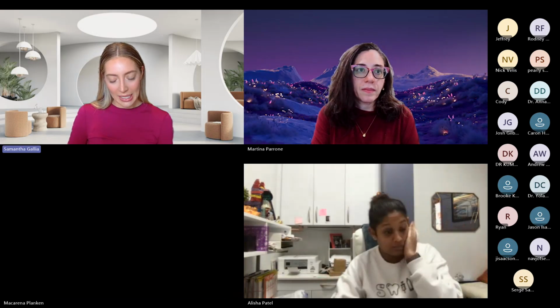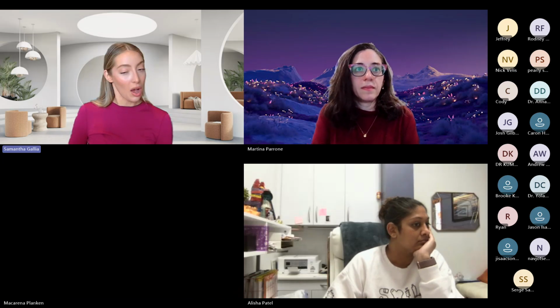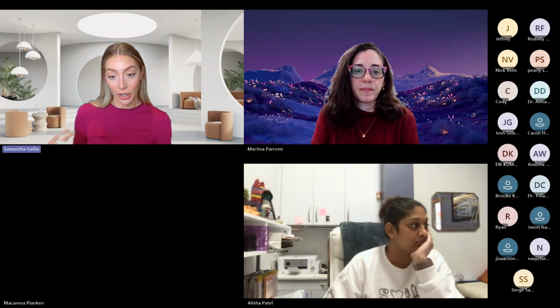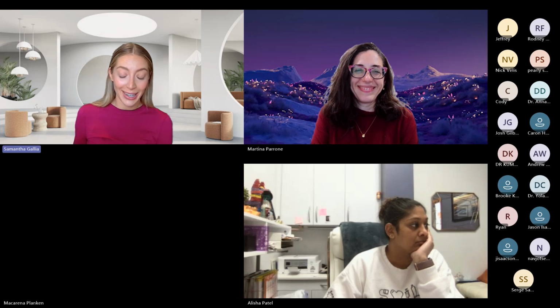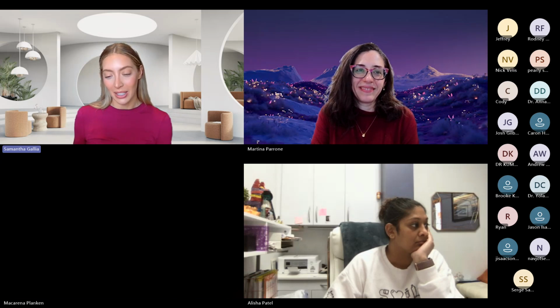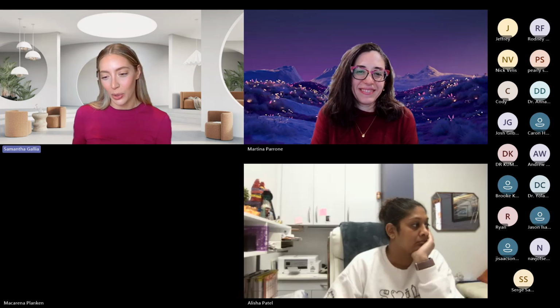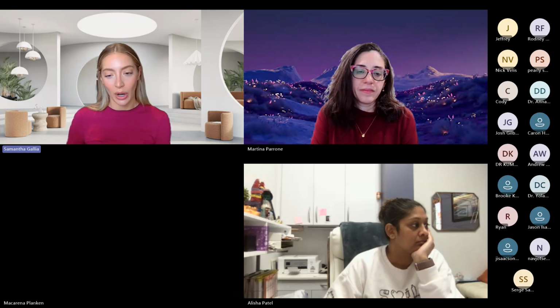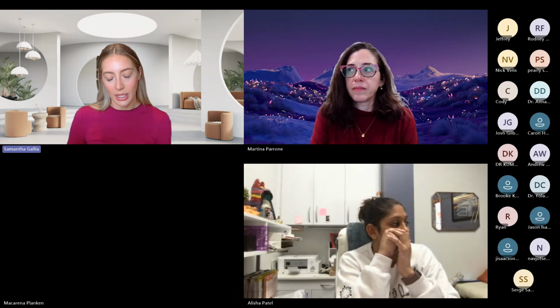And then, can we send a CBCT we take for a TMJ report? Yes, we really often write reports for TMJ purposes. When you send this scan in to beam readers, there's an option to give us as much information as you've got about the reasoning for the scan being taken. I love as much information as you'll give me because it helps us write a better report. So you want to put that the area of interest is the TMJs. You can put any clinical findings as well. Sometimes they're helpful. And then we can do a whole analysis and give you images and stuff like that.